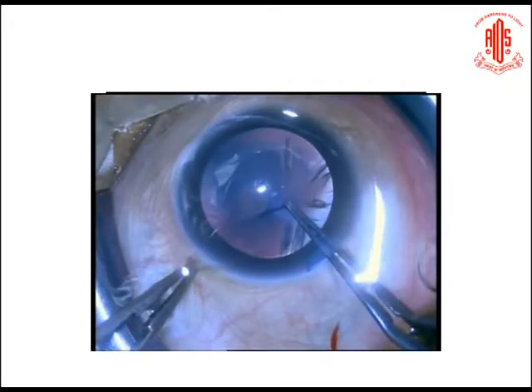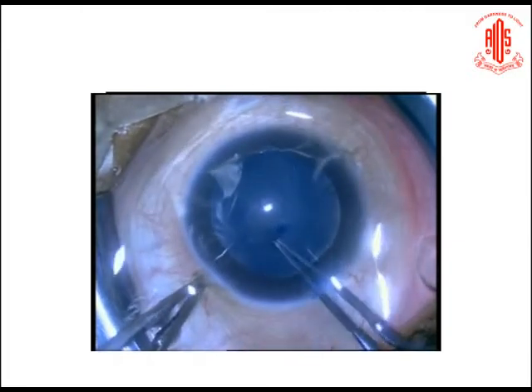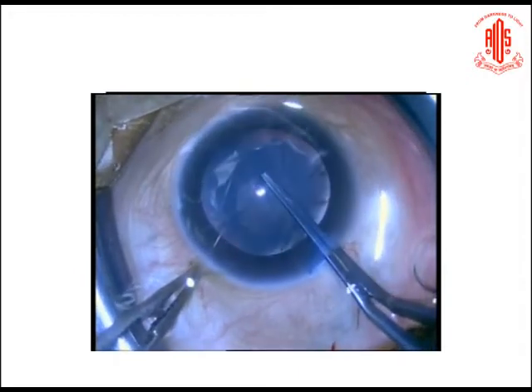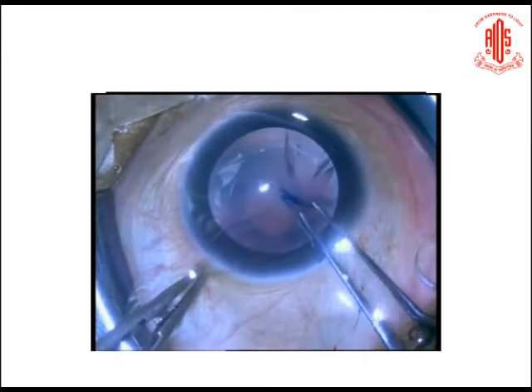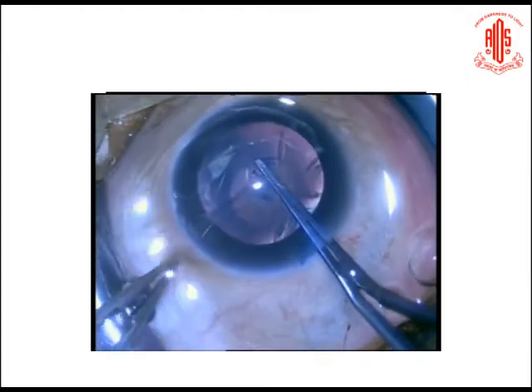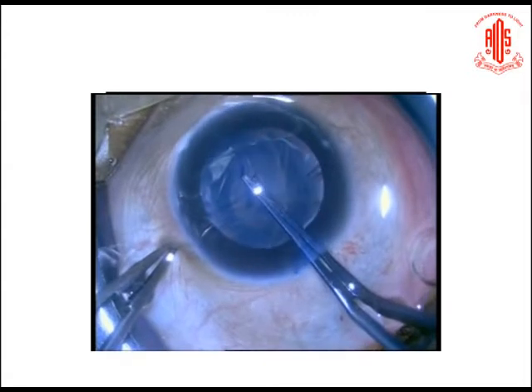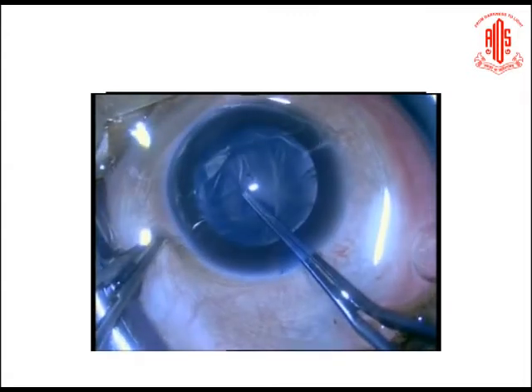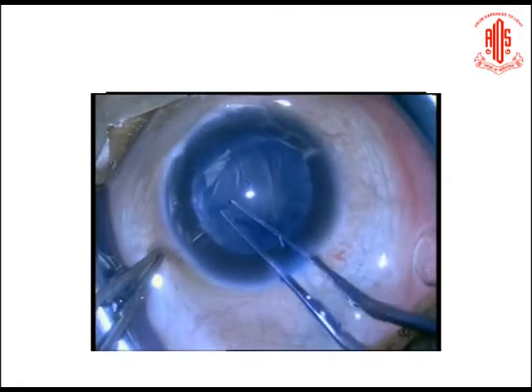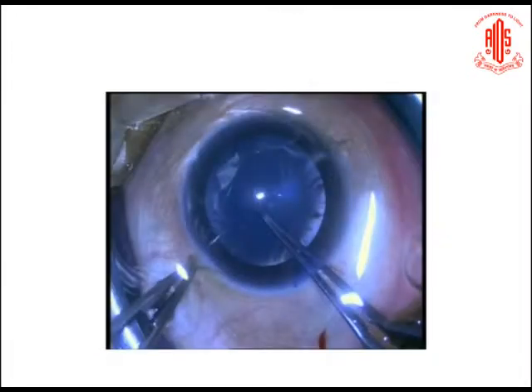Now in this first video, you see the stained capsule, and this is the Utrata. The tip and trick here is to go centripetally inside and aim for this 3 millimeters. The Utrata forceps is all the time going centripetally, as well as lifting up the capsule. So it's not like in adults where you have a shearing horizontal force. And there are no egos here. You have to grasp and re-grasp as many times as possible, because in these pediatric patients you have to achieve a very, very central, round 5 millimeter rhexis like you do for diffractive IOLs.